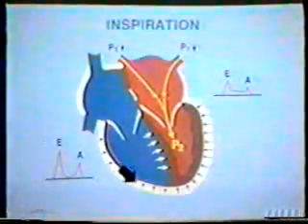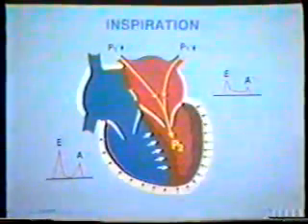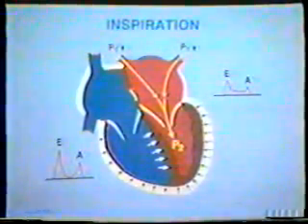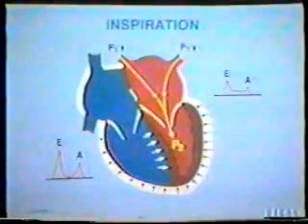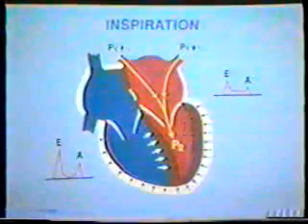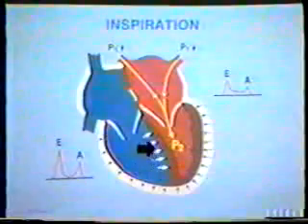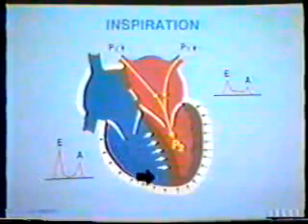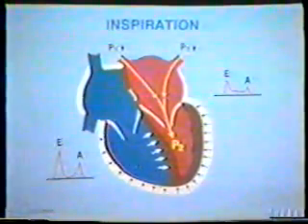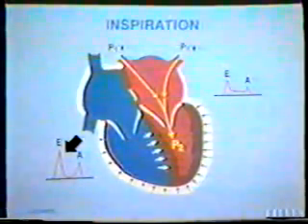The constricting peel keeps total intrapericardial volume constant, and we therefore see ventricular interdependence. The inspiratory fall in LV volume leads to shift of the septum to the left. Hence, right ventricular filling increases with inspiration, and this will be manifested as an increase in the tricuspid velocity profile.